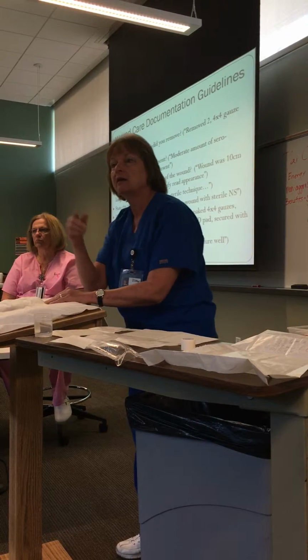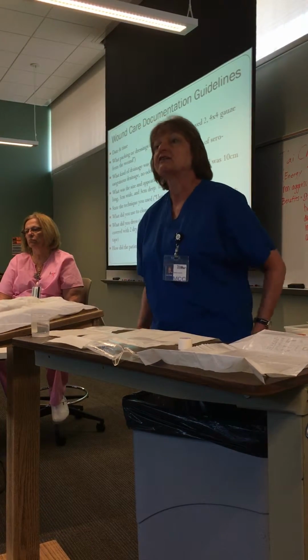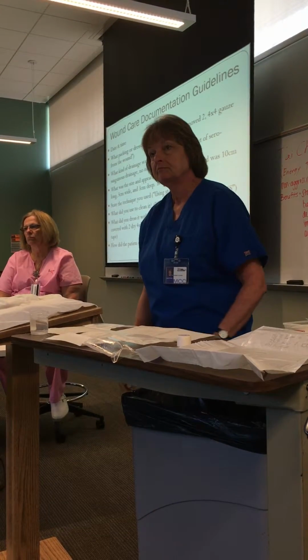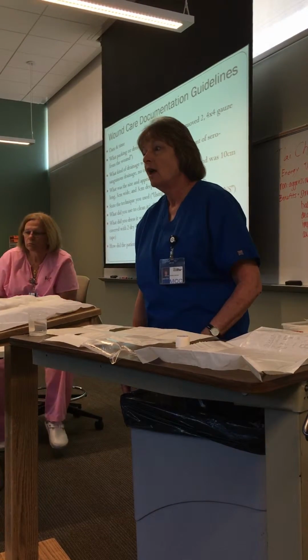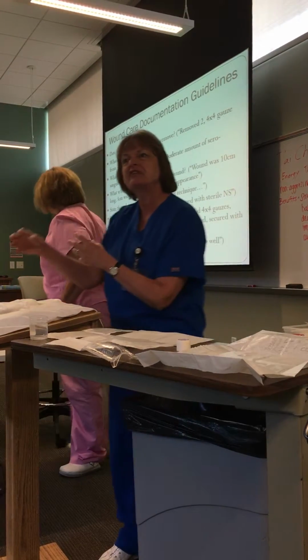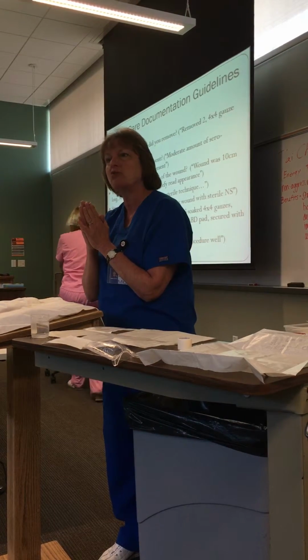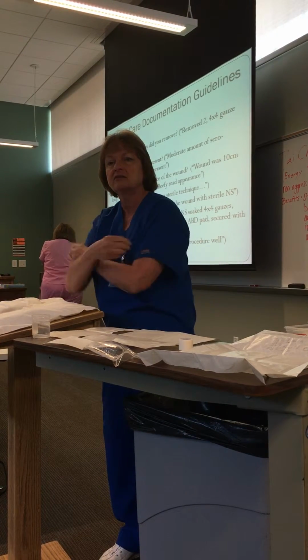Kathy? Yes, so after you got sterile gloves to grab your dressing? Yes. So you use sterile gloves and you apply the new dressing, or you just? No, those are fine, because that's the patient's own flora. I'm just not introducing anything new to the patient. That's why we have the sterile gloves on, so, yeah, no need to double sterile glove like that.